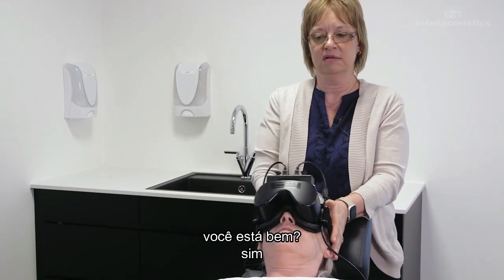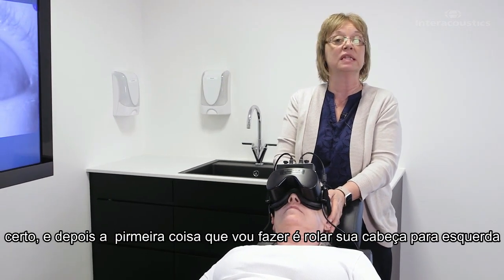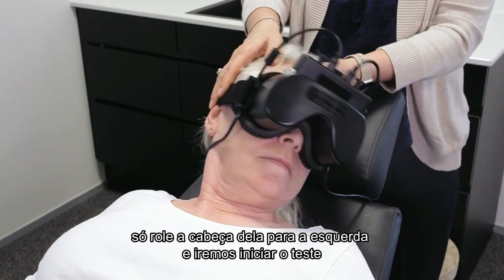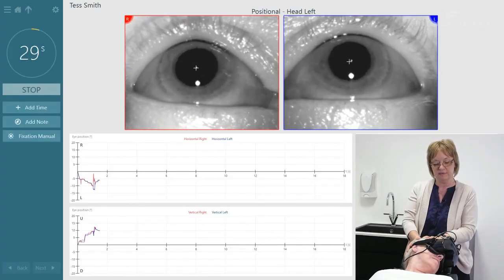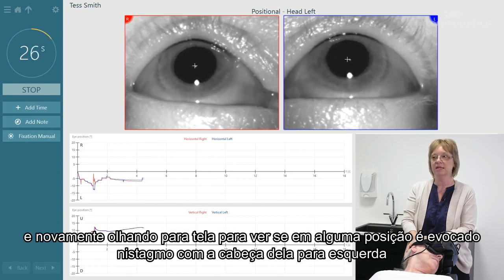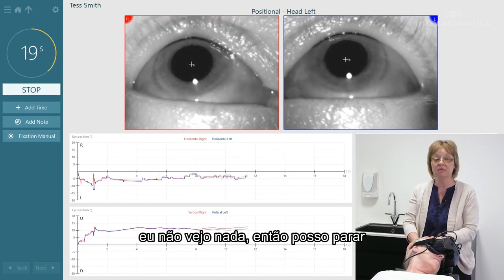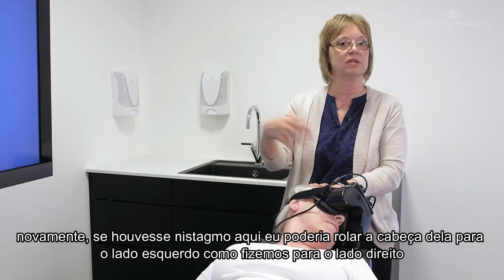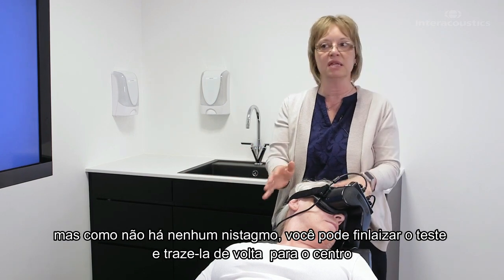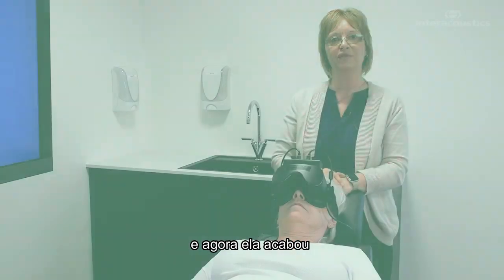Coming back to center, I'm going to let her relax for a second. Then we're going to roll her head to the left. Just rolling your head to the left — and we'll start the test, looking at the screen to see if there's any position-evoked nystagmus with her head to the left. I don't see any, so I can go ahead and stop. If there was nystagmus here I could roll her to the left side like we did to the right, but since there isn't any, we're done with the test and we'll bring her back to center. She's finished.